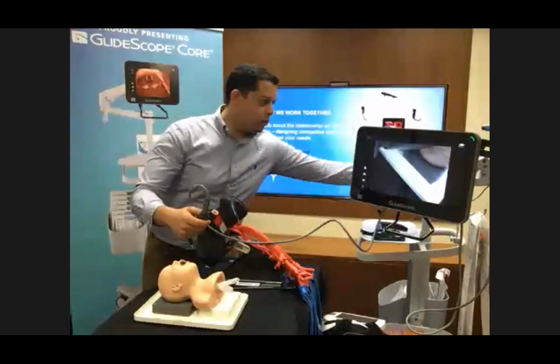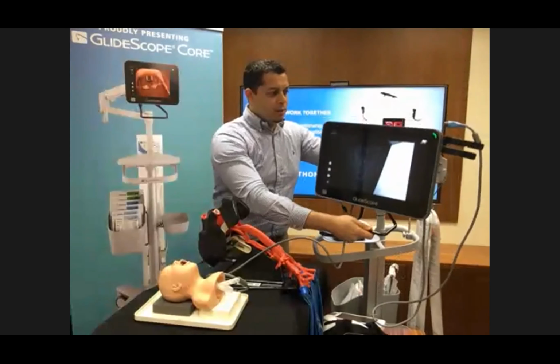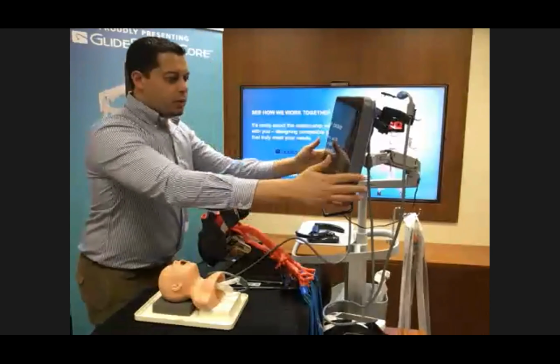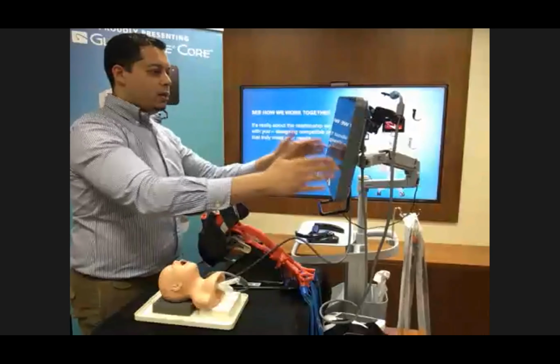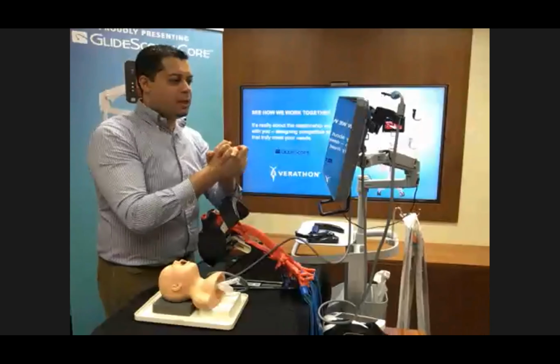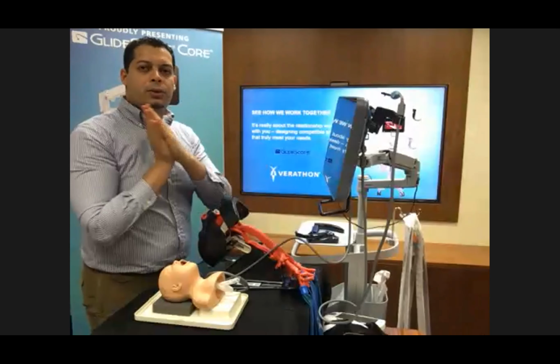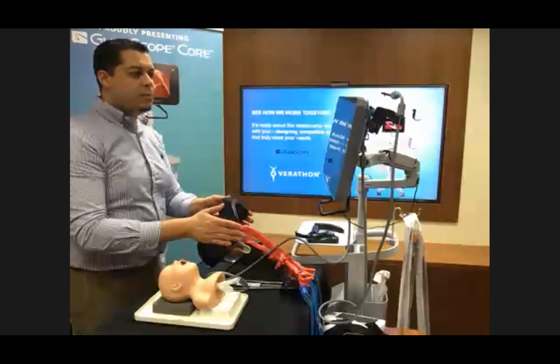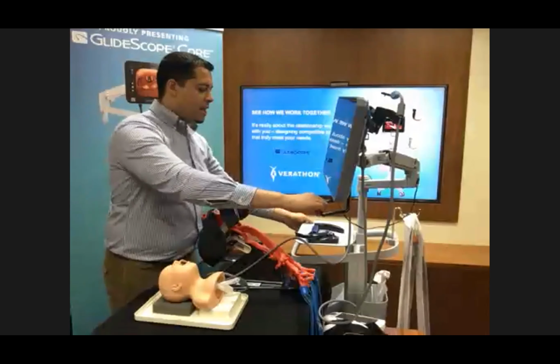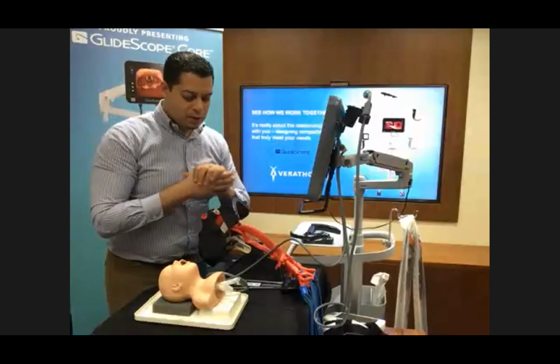This is a good thing about the workstation too. Let me take you through it. This monitor has an adjustable arm where you can rotate it and orient it so that you can use it with your direct line of sight on the patient. That's very beneficial. Most of the doctors found it really helpful, that you don't need to shift while you're intubating the patient or doing any bronchoscopy. However, you might be able to shift that by having the monitor just above the patient's chest. That's a very beneficial tip.